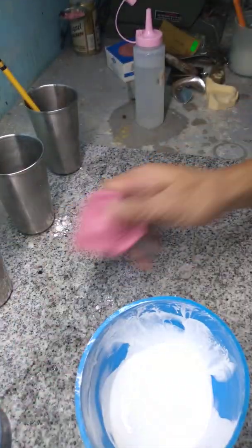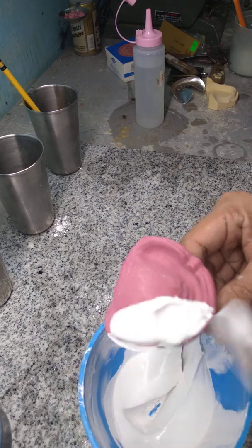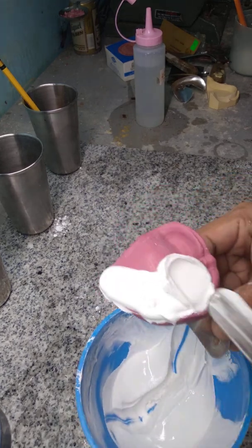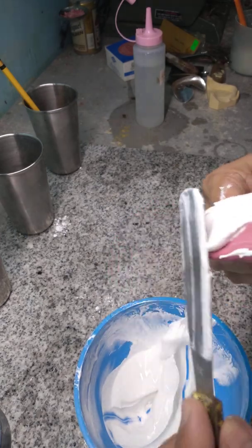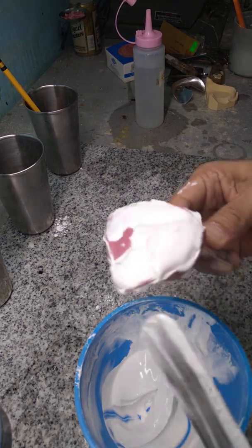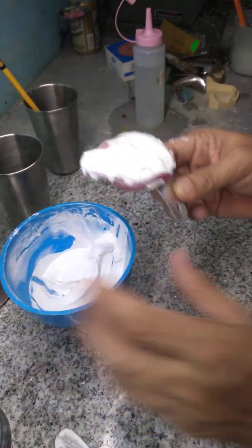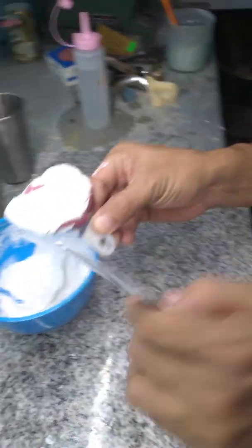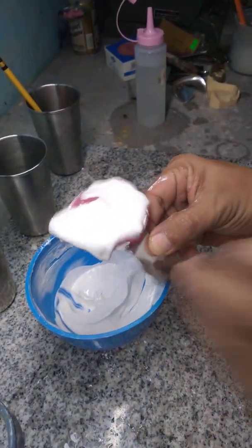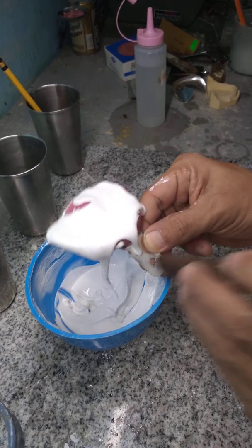Apply one side first, then fill the other side. Some say to tap the impression like this, but I don't do that. What I do is tap the tray like this, so if there are still bubbles, they will rise to the surface.